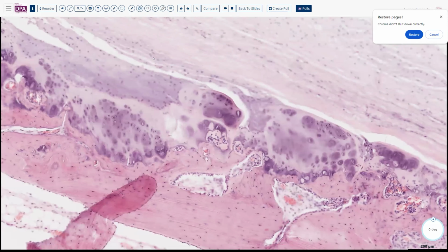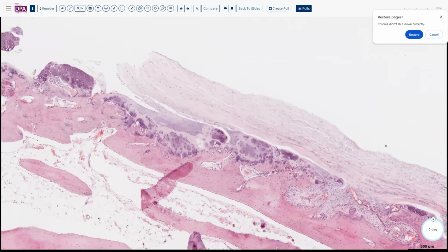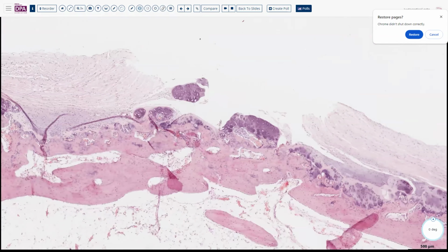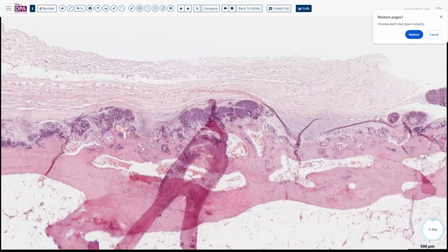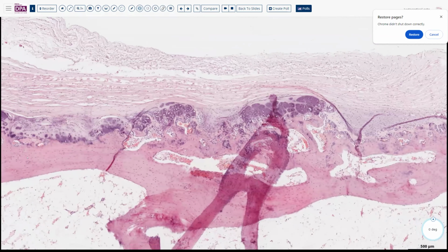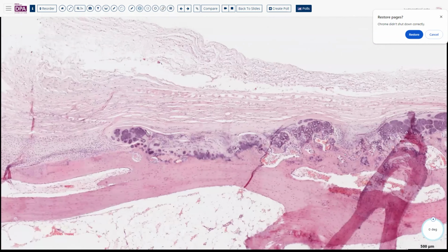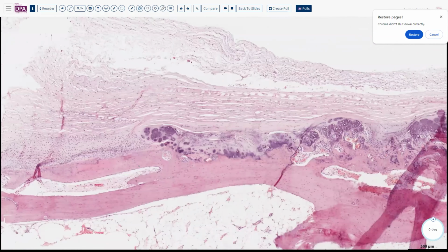So these findings, a relatively normal periosteum, a cartilaginous tissue with endochondral ossification occurring away from the growth plate, lead us to the diagnosis of an osteochondroma. And in this particular case, the chondromatous tissue is still fairly flat and disseminated along this subperiosteum type of tissue.